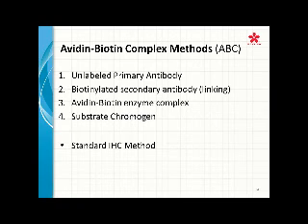In the ABC method, you have, again, your unlabeled primary antibody. You have a biotinylated secondary antibody, which is your linking reagent to your avidin-biotin enzyme complex. That's your enzyme. And your substrate chromogen is what will be applied for visualization. We'll talk about visualization once we go through the detection systems.